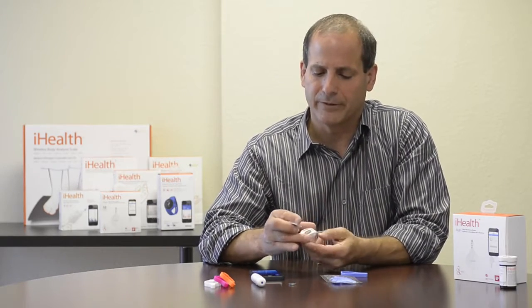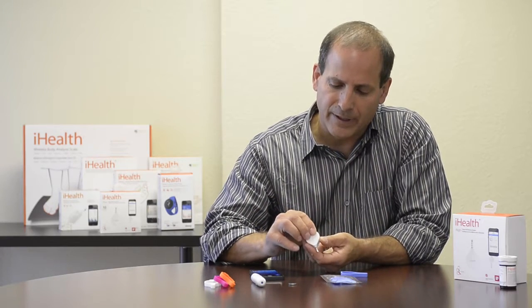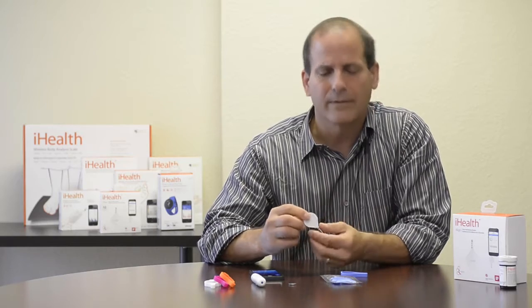Once the battery is in, I can cover it back up. I take the pointy end of the back and insert that first, then click it back and snap it into place, and now I'm ready to go.